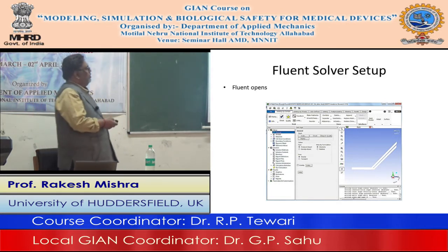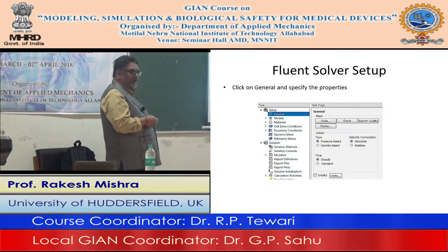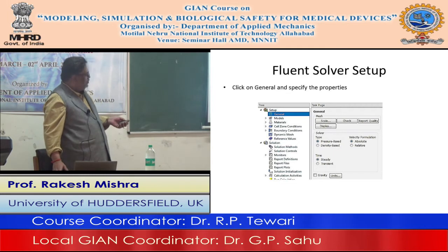Then we go to models. Which models do we use? We go to models, viscous laminar, and we use laminar model here, and we click OK. So now the condition is that flow will be laminar inside the artery, and that will be resolved by the laminar model. You can choose turbulence. If you have bigger systems, you can use turbulence with any of the turbulence models being used here.